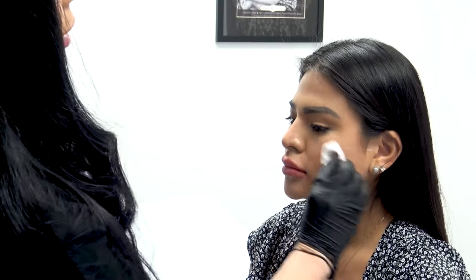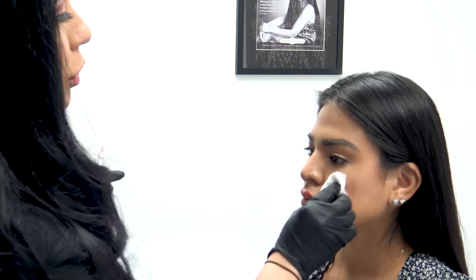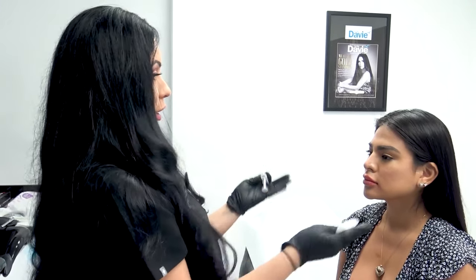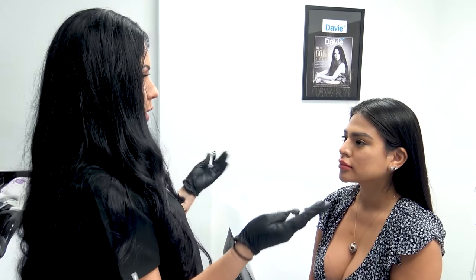Remember, we're wiping with alcohol once and then doing that second pass with HibICleanse — we want to make sure everything is nice and clean. I typically erase the lines; I just wanted to demonstrate them because they help some people. More importantly, I like to inject in a sitting position looking at the patient straight at me so I can gauge for any asymmetries.